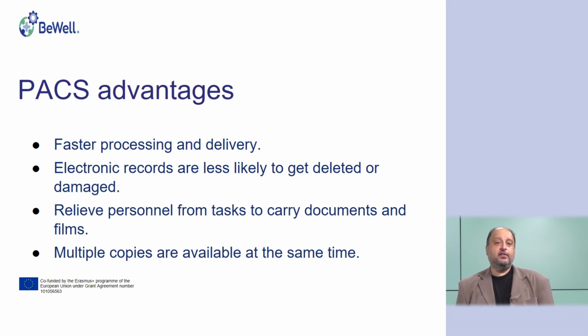Also, in some cases, radiologists may not even be present in the hospital, and can log in from some remote point, if of course it is configured in the system and allowed by the regulations. Also, electronic records are less likely to be damaged or deleted, either on purpose or accidentally. This may happen, but it is less likely with electronic records.